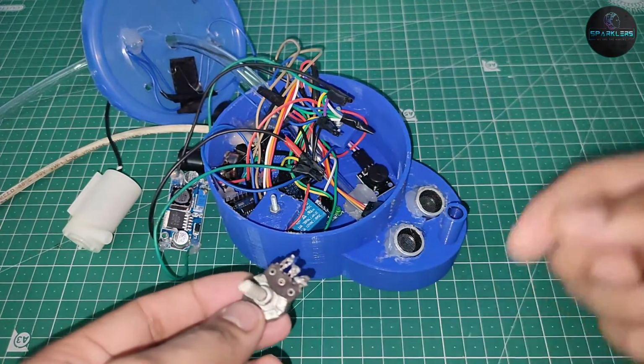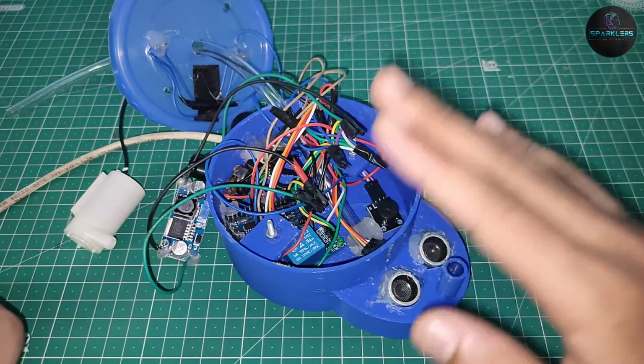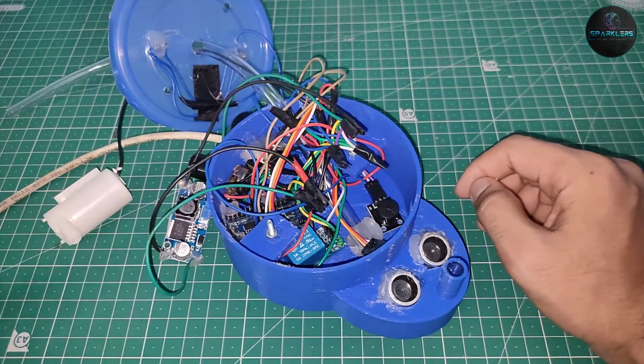So the value will be from 0 to 1023. Now using that value, you will control the speed and everything else. So this is how everything works. It will detect it from the sensor, then Arduino will turn on the relay, which will turn on this thing, and then it will pump out the water.